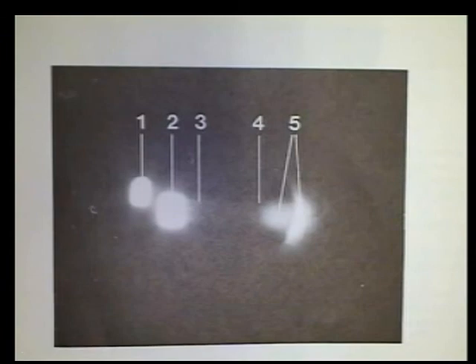Now, I mentioned that we can control the width of the beam and the height of the beam. If we narrow the width down to an optic section and the height down to about the same, we get a tiny dot of light called a conical beam. As opticians and contact lens fitters, that's not an illumination that we typically use. The doctors will use this illumination to detect disturbances in the anterior chamber.